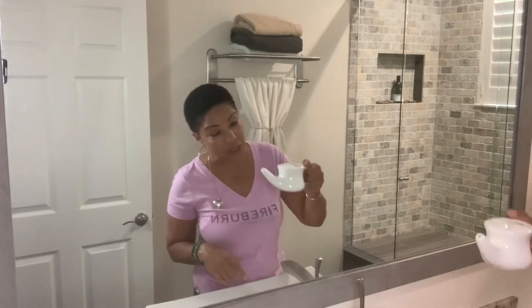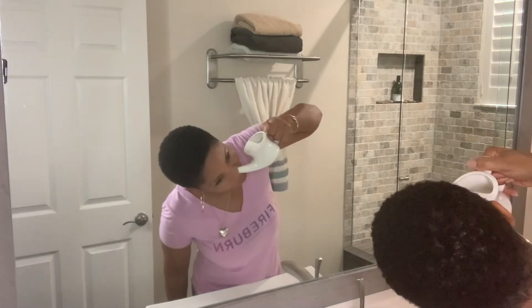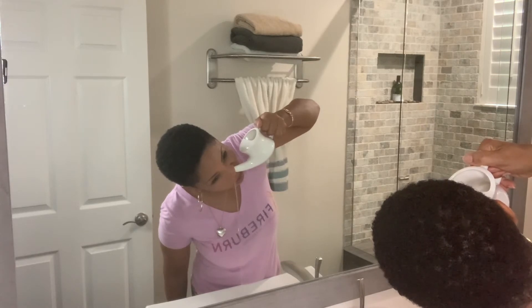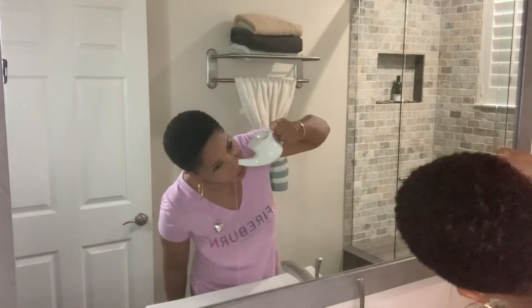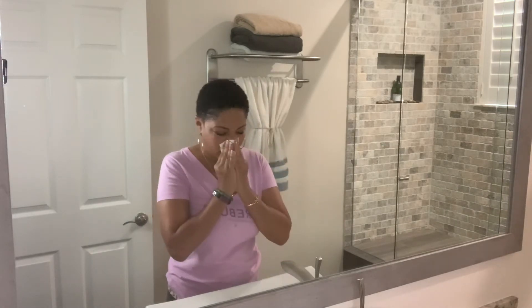Your head is going to be mostly upright — you don't want it too low or anything — but you are going to have to tilt it. You take the tip of the neti pot like so, and you'll see the water coming up and the excess water draining out.